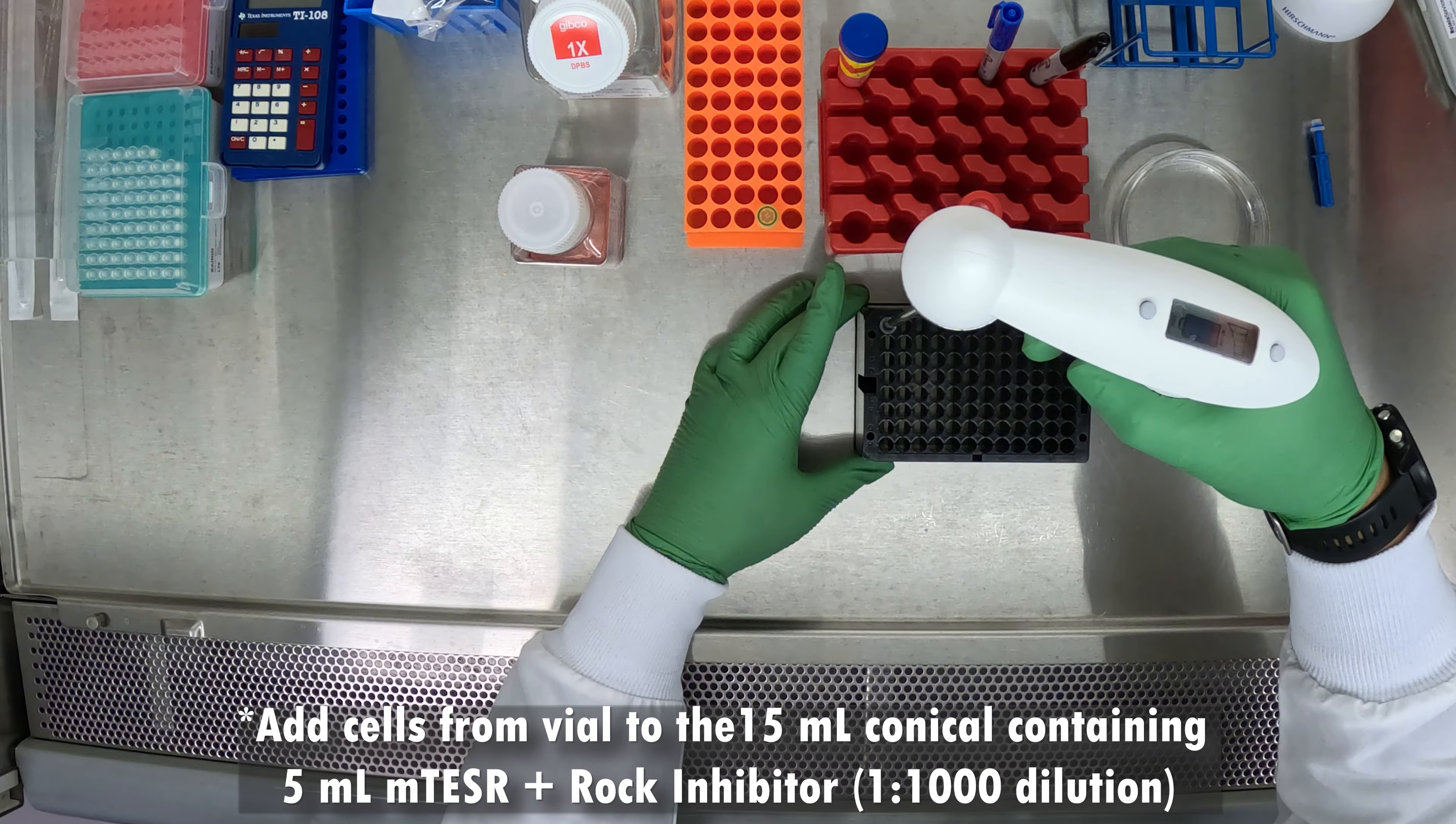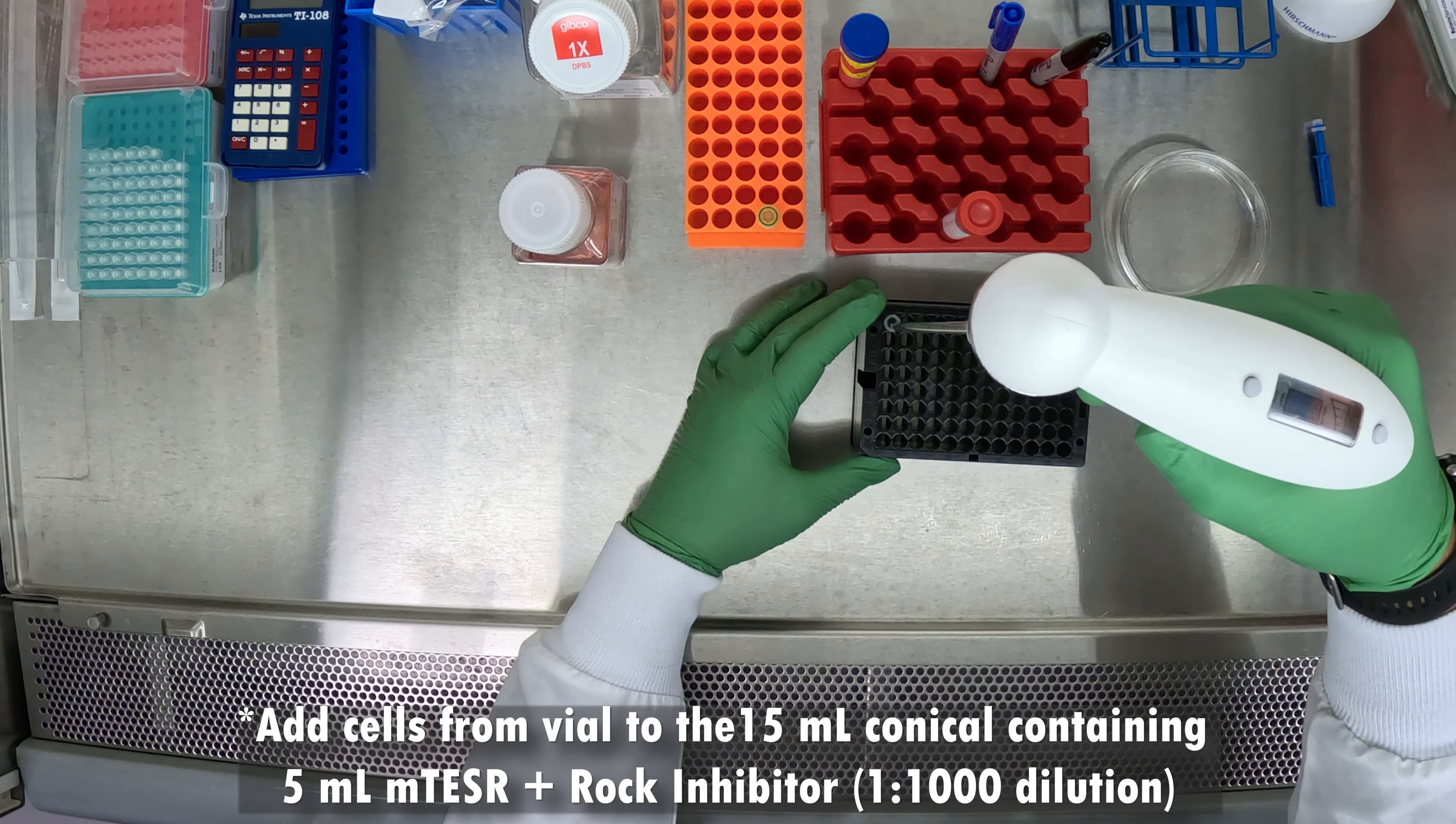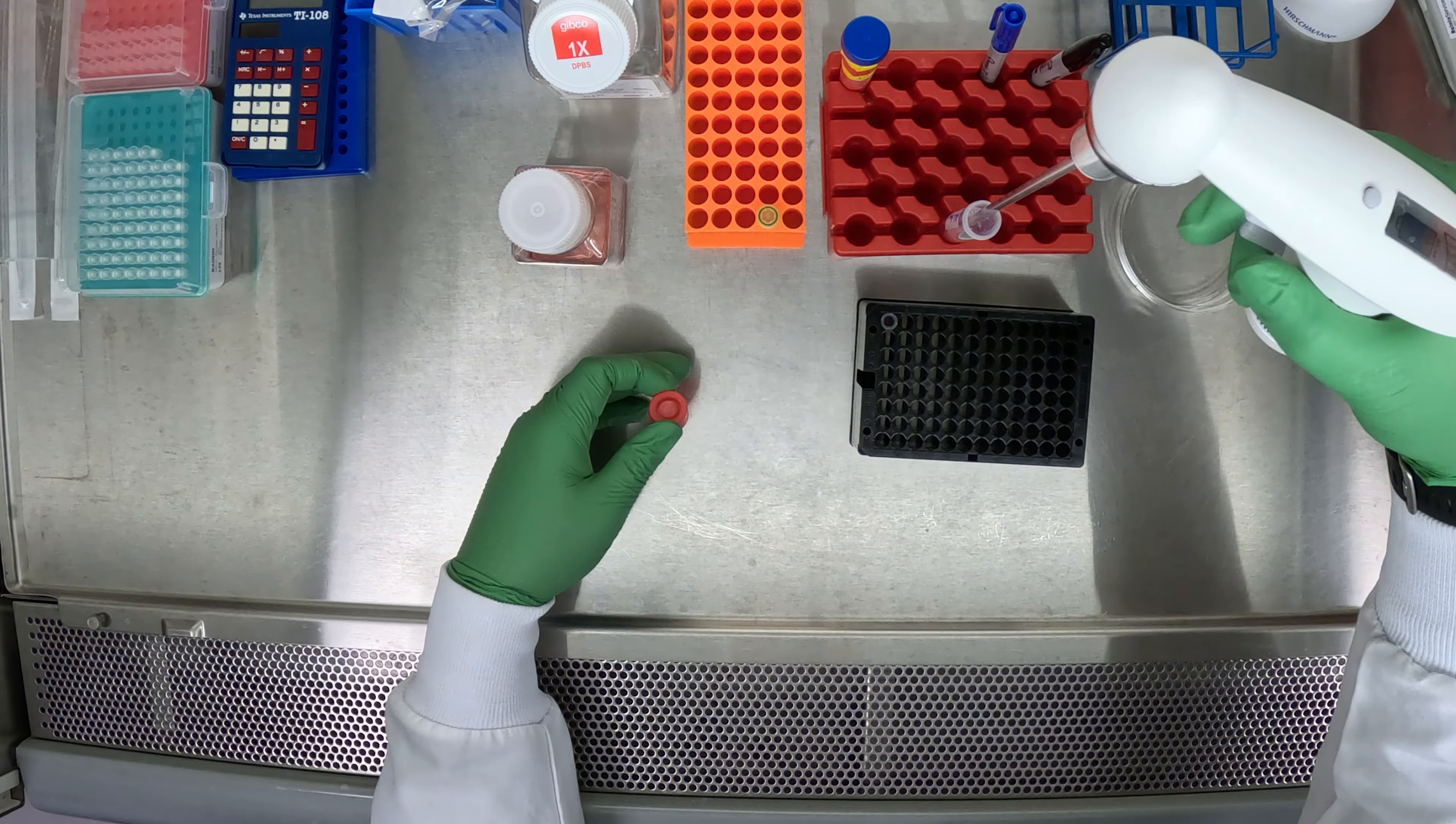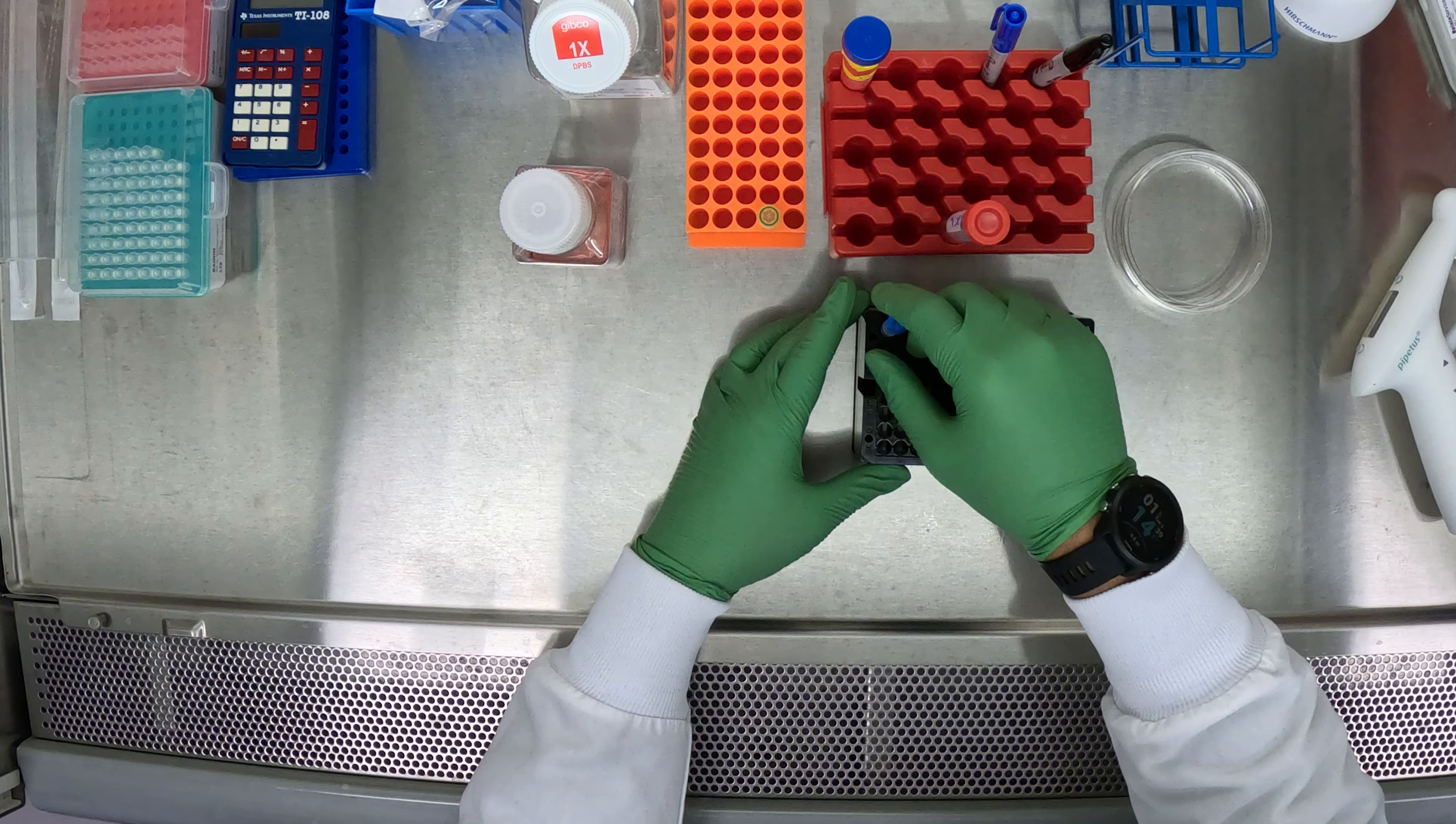When you're transferring the volume, make sure not to create any bubbles and move the cells gently. Once the entire volume has been transferred, we will centrifuge our cells to bring all of the cells down to the bottom of the tube.